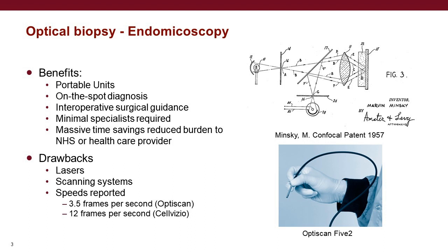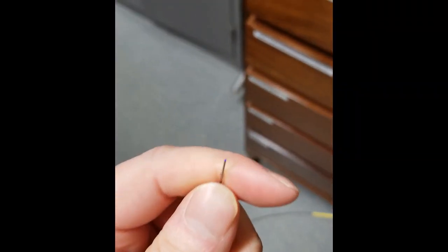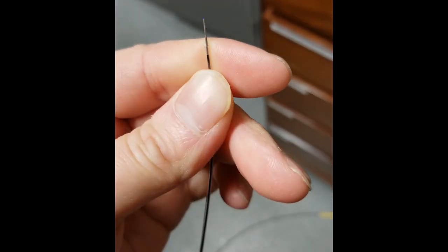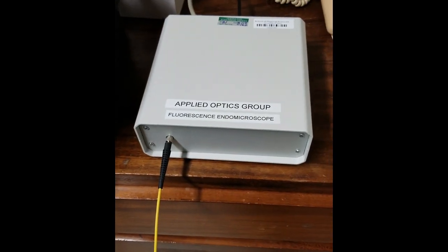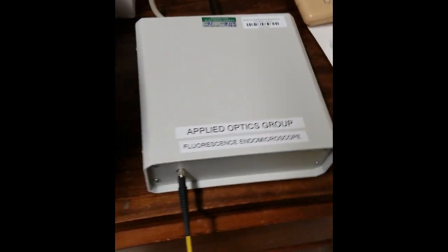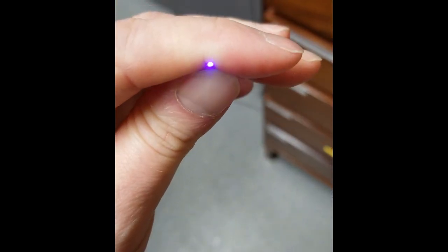So units have started to get smaller, like this one we've constructed here. This unit we've designed for outreach, but it's similar to one you would want to see by the bedside. It's small, it's portable, it's low cost. It uses LED illumination, which is usually lower cost than lasers. And it's quite portable, whereas you think about a big laboratory microscope, they're not portable. So there is a tendency towards smaller units just for practical considerations.